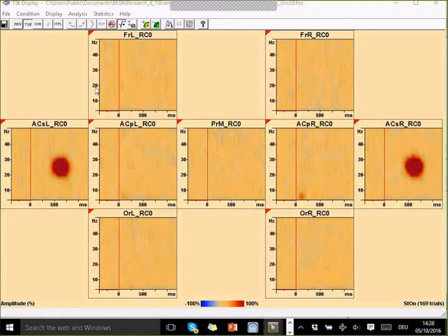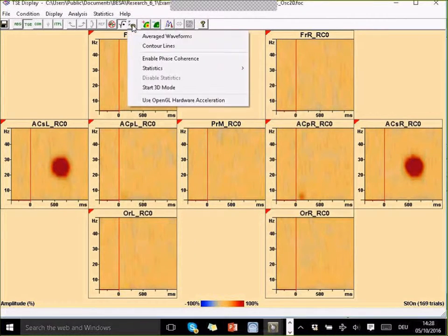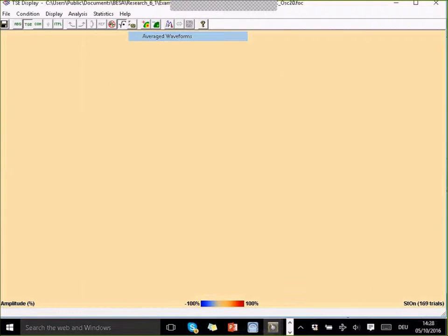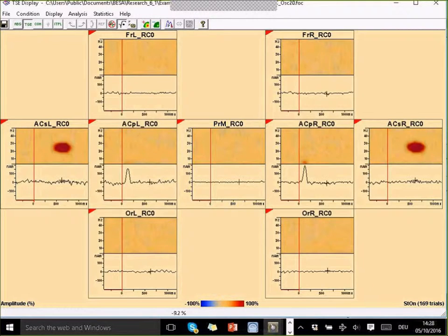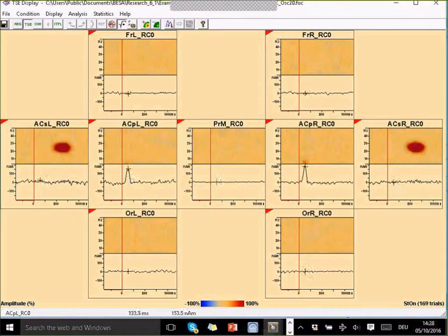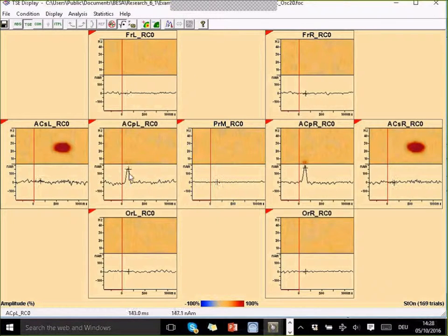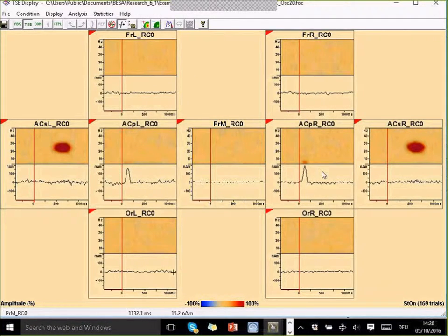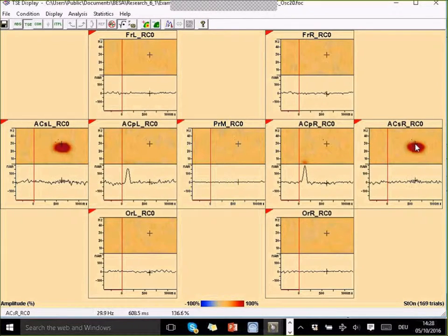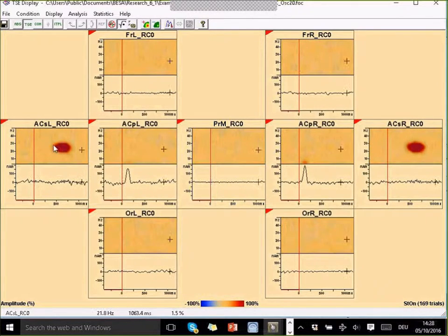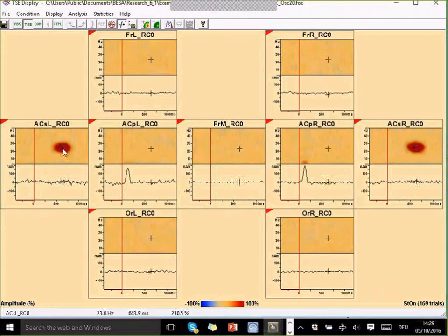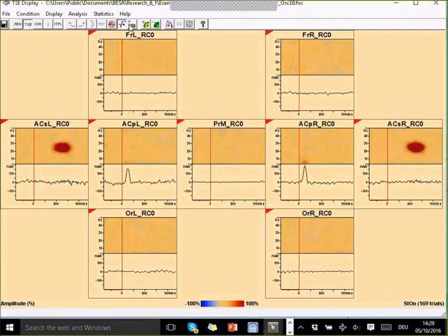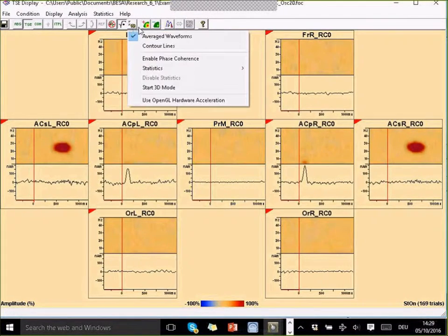If I choose to show the waveforms along with this underneath the time-frequency plot, I can see that here we've got a high evoked potential. You can see a little bit of red signal here, but not much. And the oscillatory response is nearly not present in the average, but it's very strong in the time-frequency decomposition.